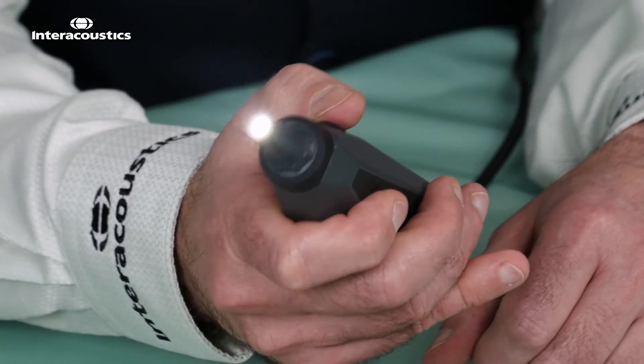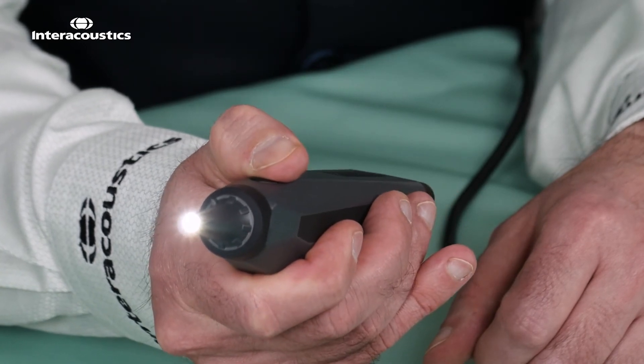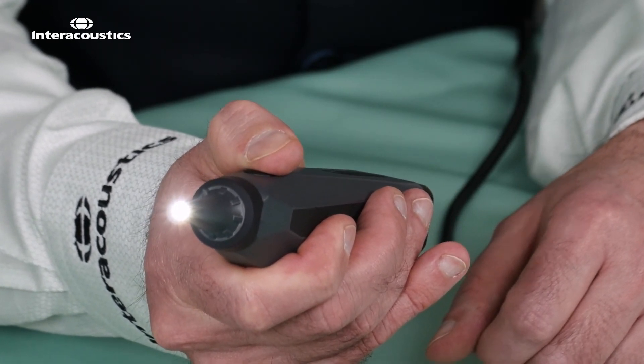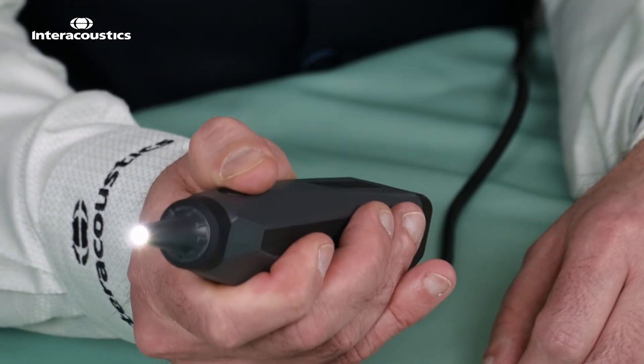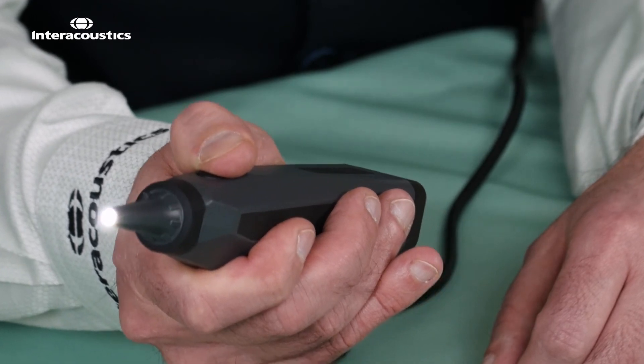Once we're ready to take an image, we can connect the viat to the laptop. We have the button on the front of the unit — pressing and holding the button will capture an image which we can store in our software. Pressing and holding the button for three seconds will change between right and left ears.